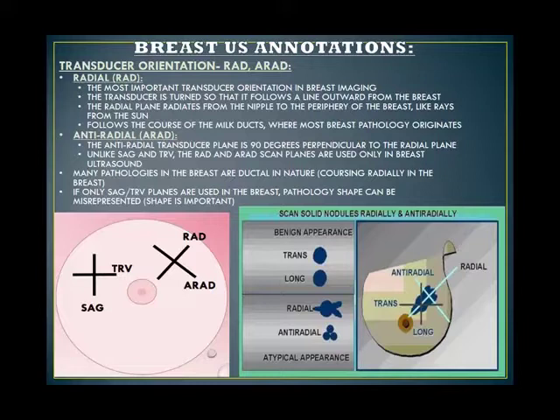So I'm against my ray of sunshine, or anti-radial. It's exactly 90 degrees, orthogonal to that plane.